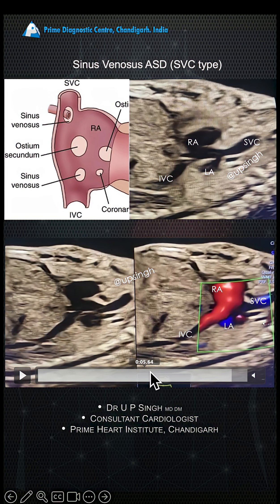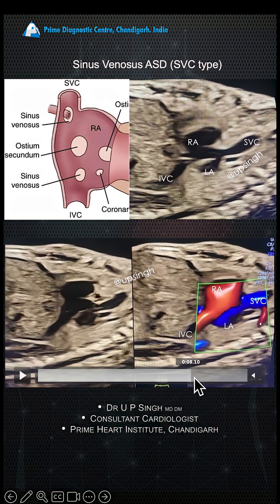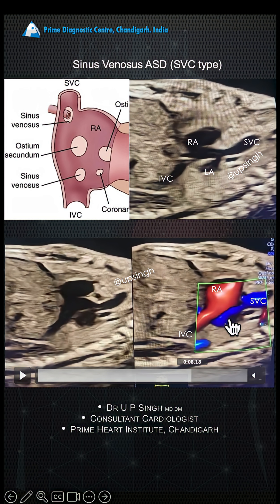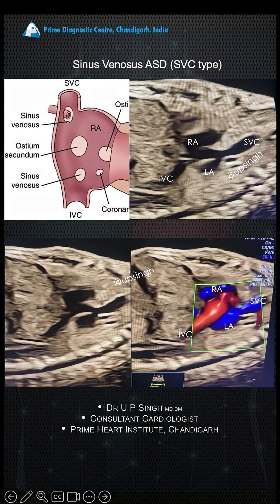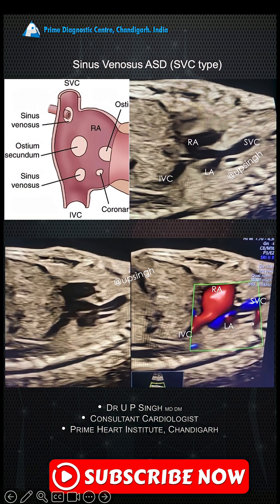Here you can see the blood going into the left atrium also.